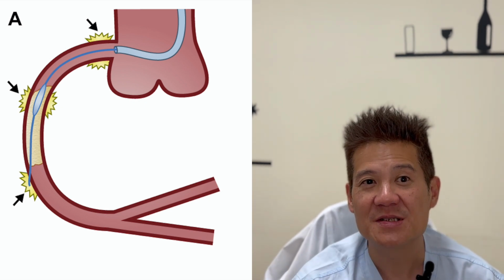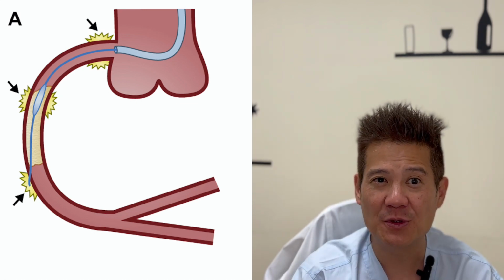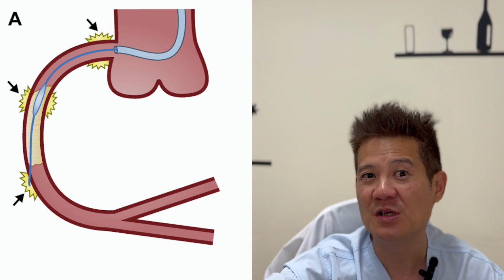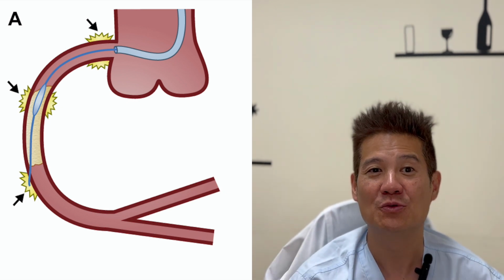Also, when we do balloon-assisted microdissection to break the proximal cap, we rupture the balloon, and when we rupture the balloon, the contrast shoots out, and that can shoot into the subintimal space, causing a connection. Similarly, accidental balloon rupture inside the CTO body can cause a connection between the true lumen and extraplaque space.